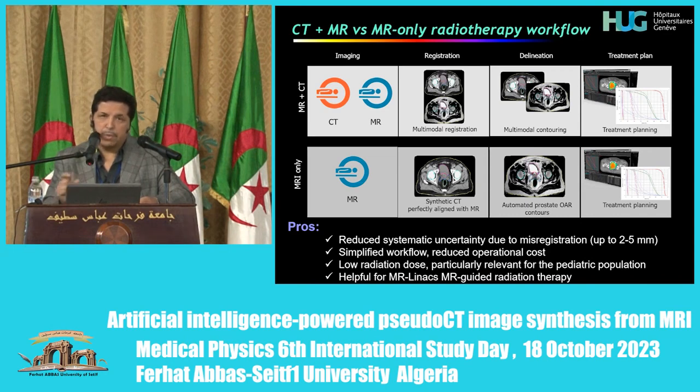One of the problems that we face during the registration process is the temporal variability between the CT and MRI acquisitions, which usually don't take place during the same day. You see a couple of examples here. Even if we can easily delineate the, I think you see the mouse here. No, you don't see the mouse for some reason, anyway.